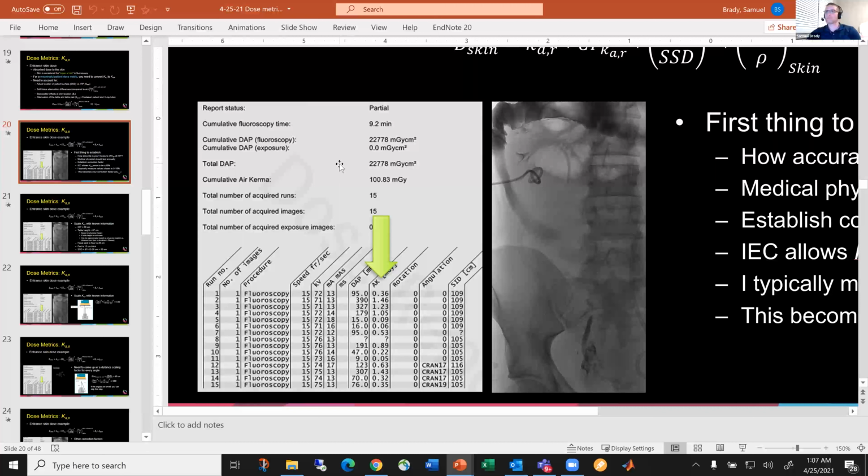Sure. So the next question is about the dose metrics. Do you recommend setting up the DRL or QC alert level? Should it be KAP or DAP or fluoro time, or is only the DAP alone or the air kerma alone enough? If multiple metrics are required in clinical practice, how do we prioritize which one is the most important? Yeah, it's a long list, isn't it? There's a lot to do here.